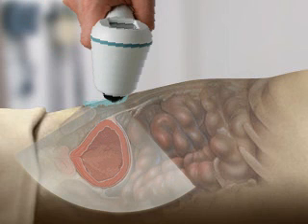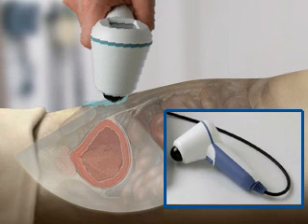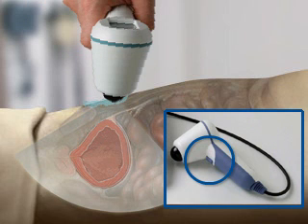For most patients, this means angling the probe slightly toward the patient's coccyx, or tailbone, so the scan clears the pubic bone. Press and release the scan button, located on the underside of the probe. When you hear a beep, the scan is complete and a bladder volume measurement is displayed.